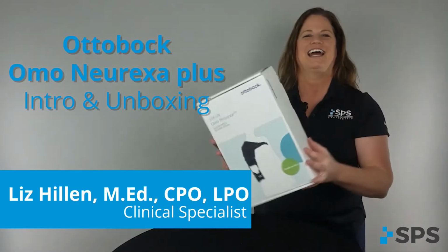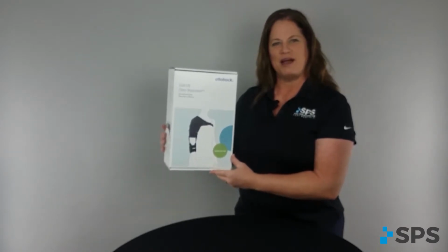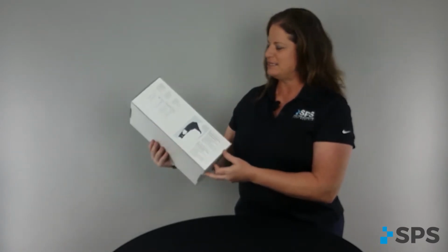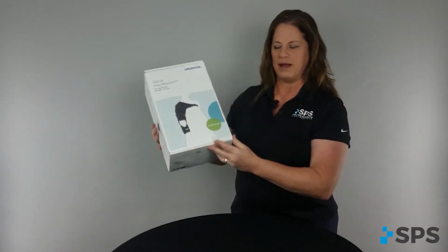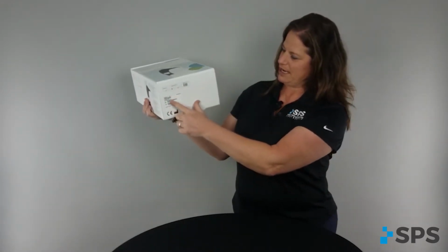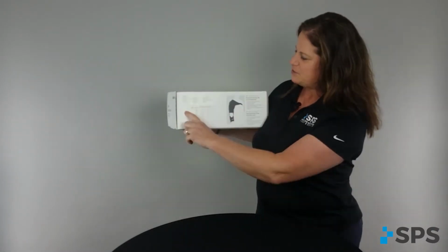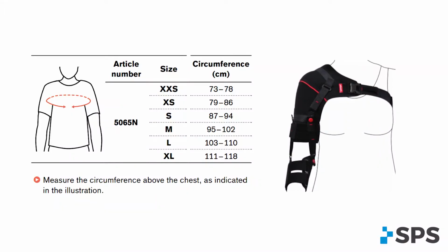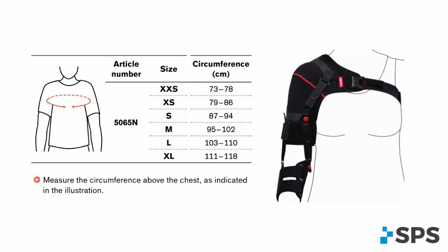In this segment, I will review the Ottobock Omo Neurexa. When you receive this box from SPS, you will notice the product number is listed on the box, also located on the bottom here, as well as a sizing chart. The circumference of the chest line will provide you the direction as to what size is appropriate for your patient.